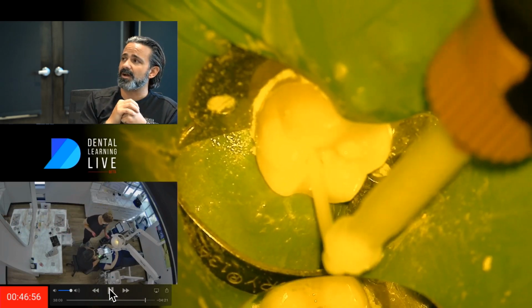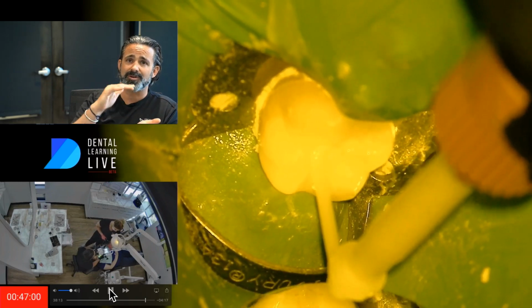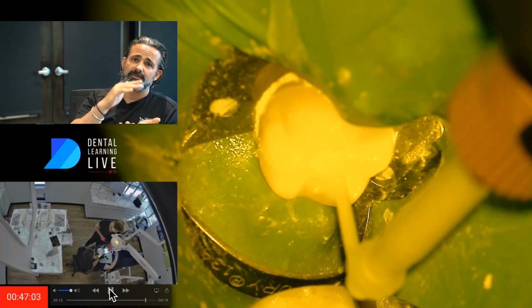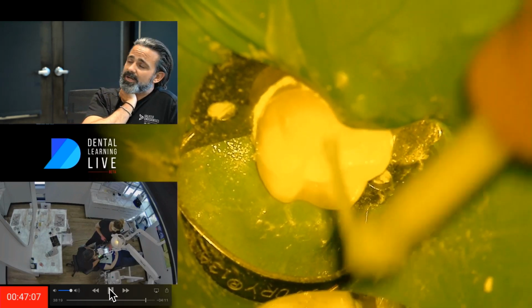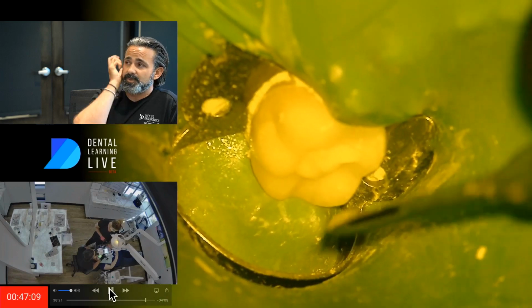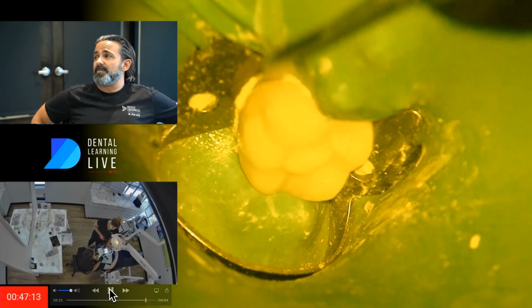A lot of guys like composite. You can use a glass ionomer. I'll do this commonly, where I'll put it on the floor, I'll set it, and then I'll just layer it up, although it is dual cure. And the shrinkage on this product, the C factor, is supposed to be ideal for this, per the manufacturer. And then I'll just kind of play with the access.